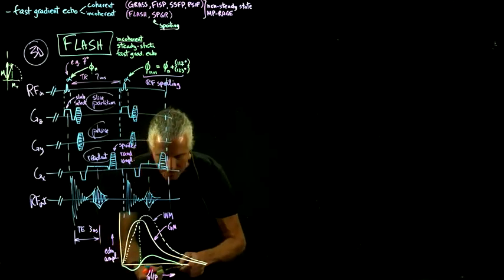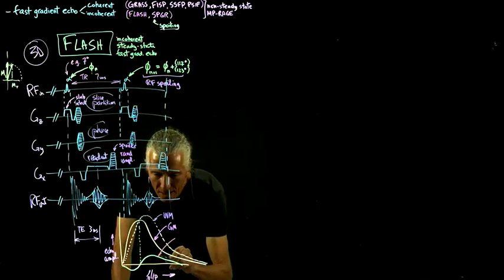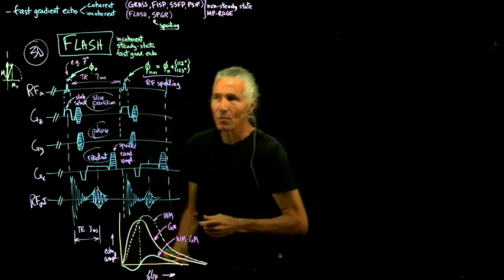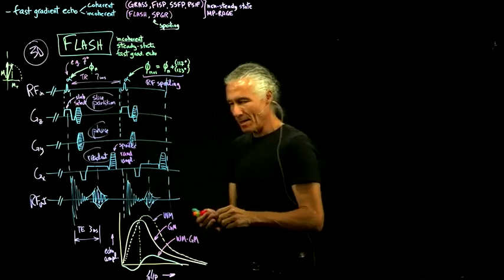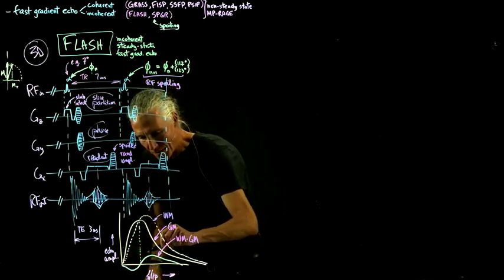This is white matter minus gray matter. So if you do white matter minus gray matter, this is going to be your optimal flip angle.